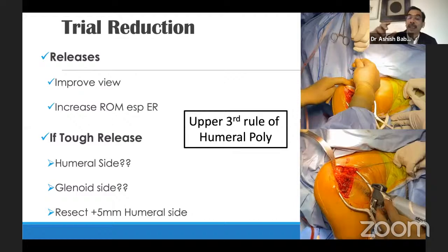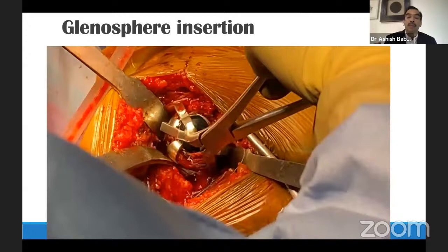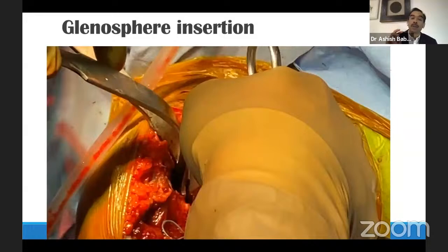Ensure with the anesthetist that the muscle relaxant has not worn off, because I've been caught out a couple of times that way. To be honest, I'm going to speak for all of us here. This is the most fiddly, embarrassing step. It is difficult, so you need to get used to the process.